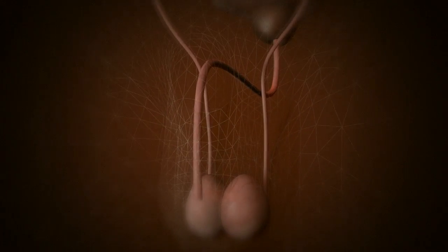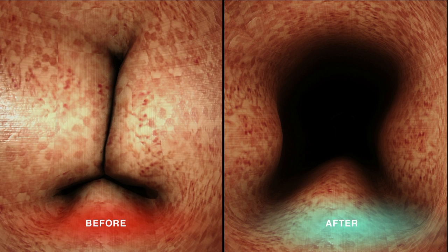Thanks for joining us. We'll firstly recap what BPH, benign enlargement of the prostate, is. This is the view we get from a telescope when looking up the urethra into the bladder. You see here the prostate, just before we get to the bladder, is enlarged and is pressing into the urethra, causing restriction of urine flow.